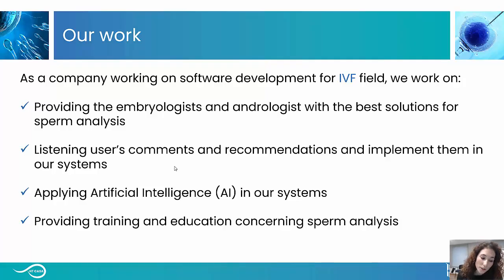So this is one of the points also that I wanted to emphasize. We also have trainings face-to-face or online, not only about automatic systems, but also about sperm analysis in general.